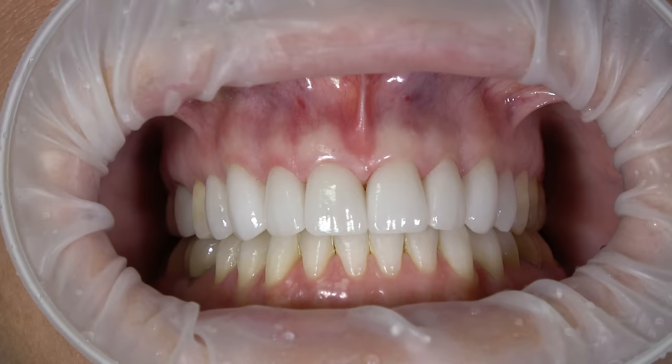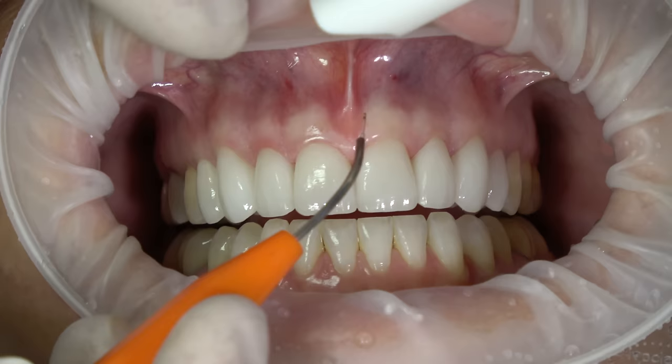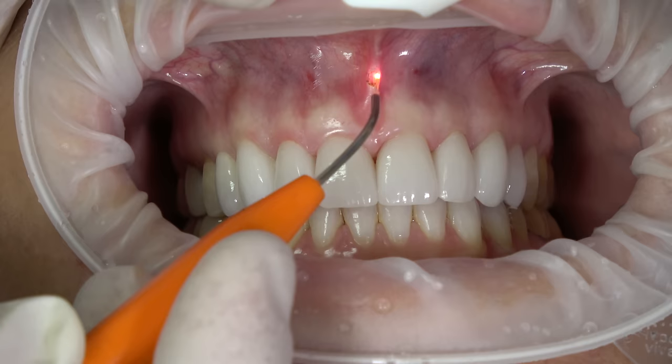We have high-speed vacuum, and I like to have a 2x2 gauze with a little bit of water, because we'll start to build up debris on the tip and can just wipe it off. What I do is just start the cut. The nice thing about this is we're not going to have any bleeding.